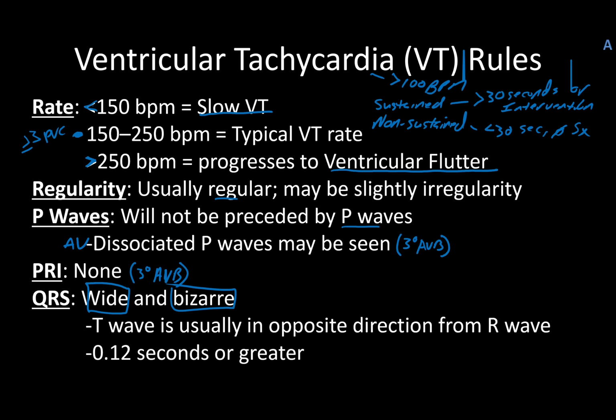And so that's the idea that I'm trying to get across here, is that take the time to say, you know, this is sustained V-Tach, this is non-sustained. Using these words is going to help the physician or care provider that you're speaking with have a better understanding of what you saw on the strip.